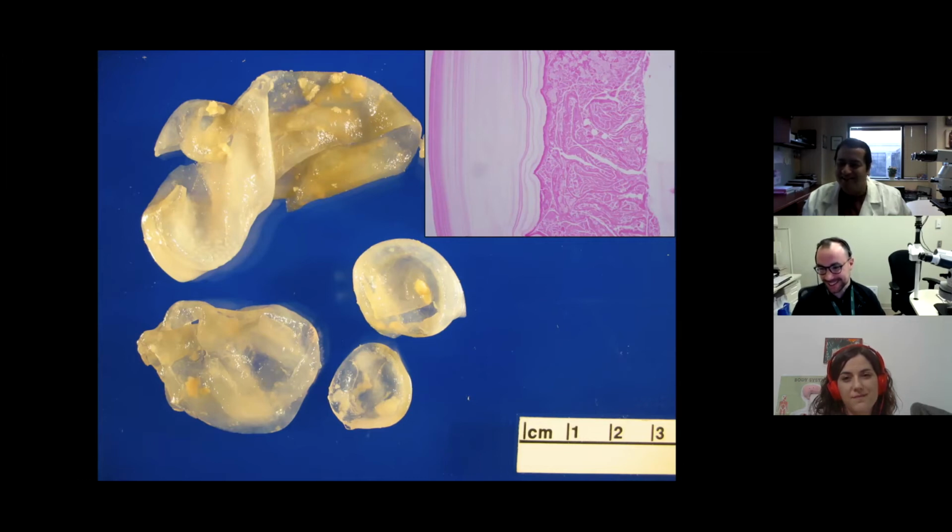Wow, that's bizarre. I have to say that I've only seen one hydatid in the lung in like 14 years of practice here in the US. But in India, when I was a resident, this was like every day or every week you would get one case. Not in the lung, usually in the liver and in some other locations. But this was so common in India.